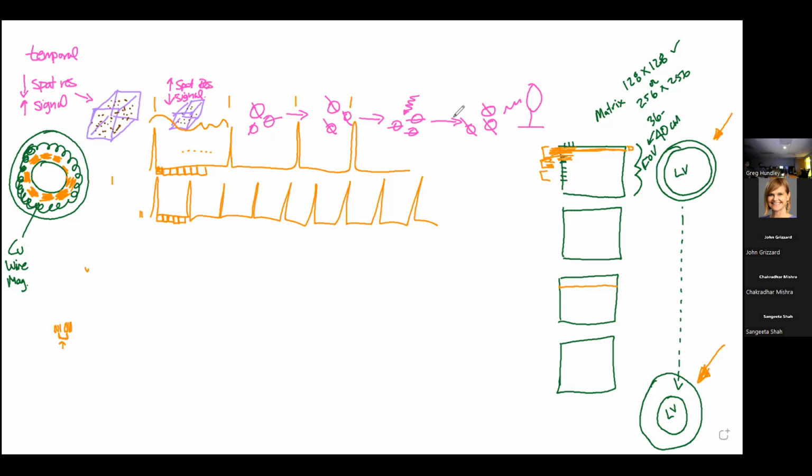So the key point, this was called phase encoding grouping. Because we grouped these phase encodes, all those little lines, so that we could get through collecting all the frames on the right side of the screen in the 8 seconds. But now we've got a faster heart rate, and we've got to have a higher temporal resolution. Okay, we've got to have little teeny groups. Instead of here, where we're grouping this many phase encodes together, here we're only going to group a few together.